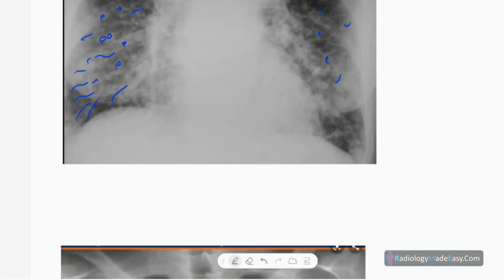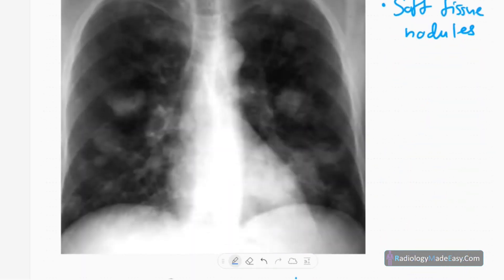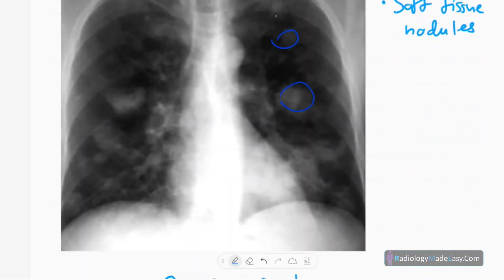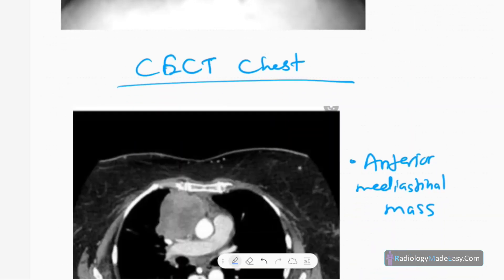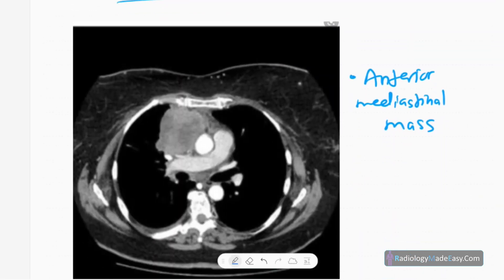Another presentation is multiple soft tissue density nodules in the lungs with no fluid levels, no air bronchograms, and no calcifications. These multiple nodules give a cannonball appearance and represent lymphoma in the lungs.